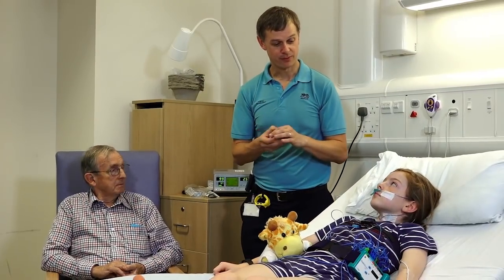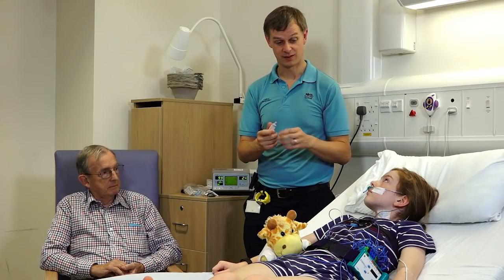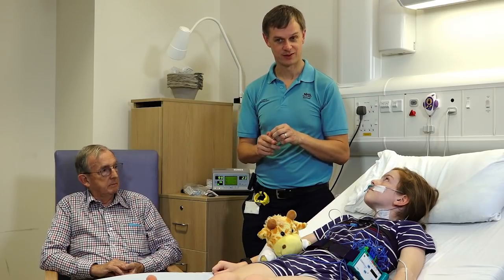That's just finished with the actual set-up part. If this was a normal test and you were staying overnight, what we'd do is get you to settle down, get the bed out for mum, dad, or grandpa to put next to you, then put the lights out and start the test.